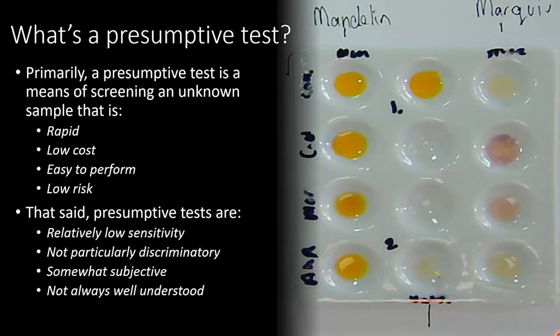That all said, presumptive tests are relatively low sensitivity, not particularly discriminatory, which means they suffer from false positives, and are somewhat subjective. If you look over here, we can see a negative result which looks pale yellow, and a positive result which looks somewhat purple. But the bottom two samples are harder to classify — one appears pale purple and the other has a slight purple tinge, making it difficult to attribute whether those would be considered positive or negative results. Finally, they're not always well understood, meaning the chemistry concepts underpinning them are not always well known.